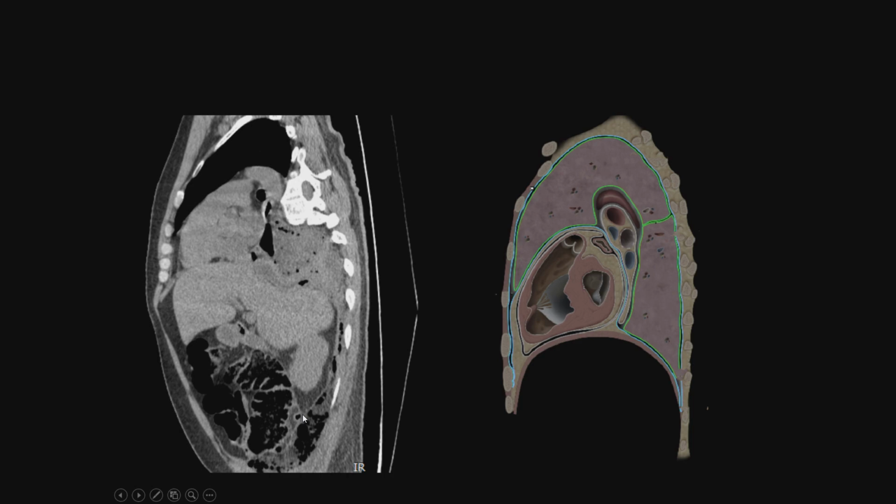Here's the appendicitis. It opened to the retroperitoneal space, the retrorenal space, and went through the posterior renal space to the subdiaphragmatic space. Here's the continuation of the empyema. And this is very interesting because everything started to make sense for us.